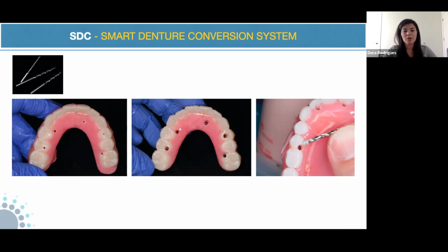There's this set of drills that you use to actually open the screw axis. The very tiny drill marks the hole. You go from the bottom of the cylinder and mark the spot on the occlusal surface where the screw axis will be. And then the second drill just widens that hole to get to the cylinder. And that third drill just engages on that little peek head of that screw that was inside the ti base, protecting the ti base from the acrylic getting to it. So once you remove that little peek material, you're ready to just finish all the borders and all the flanges and make it nice, pretty, ready to insert.